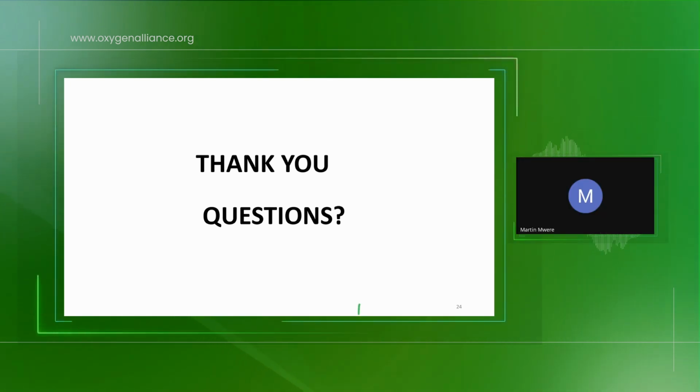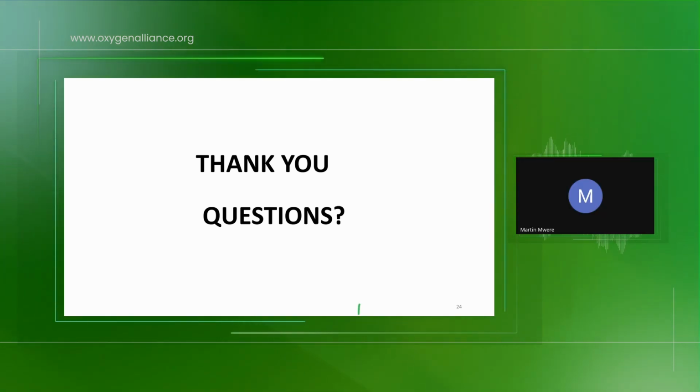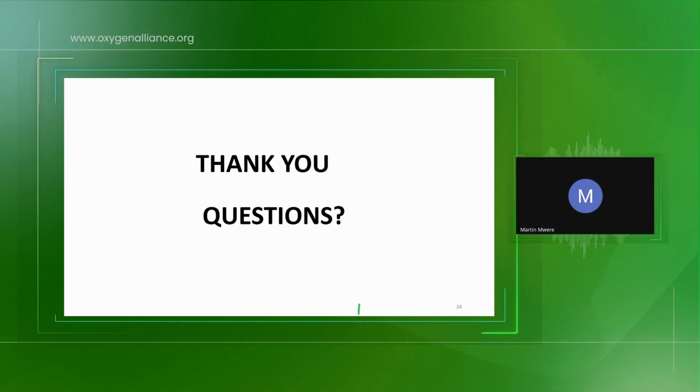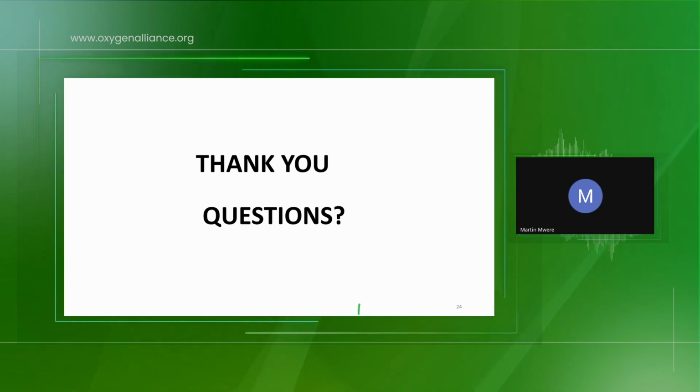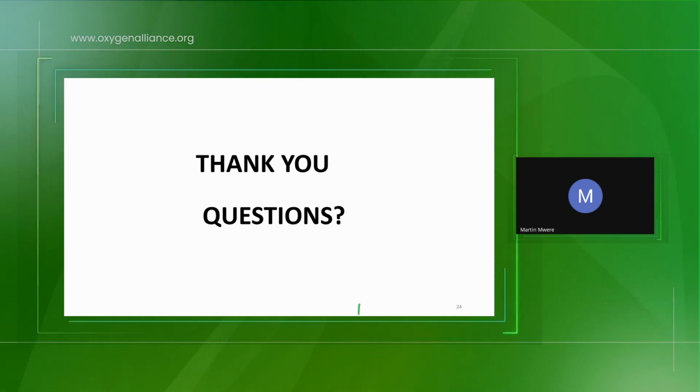Thank you. The meaning of decommissioning, it means you would not want to continue using the chair. And mostly this chair has the mechanical connections. As the mechanical connections failed, yes.